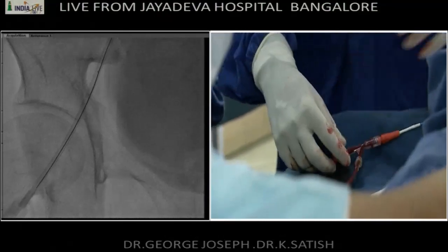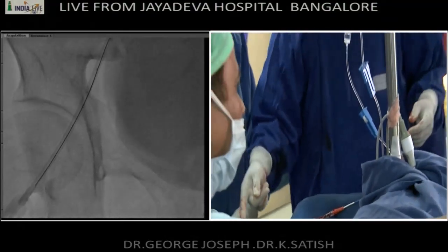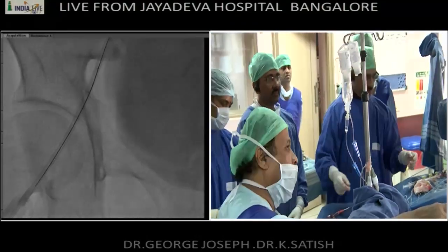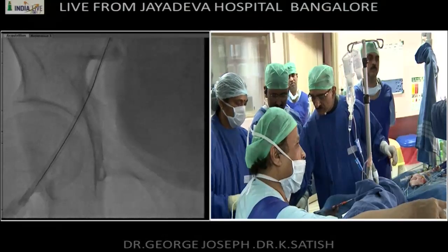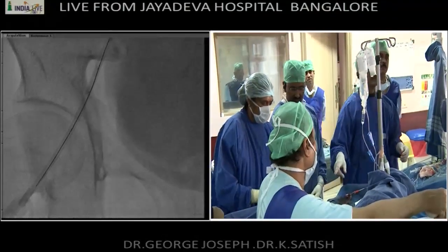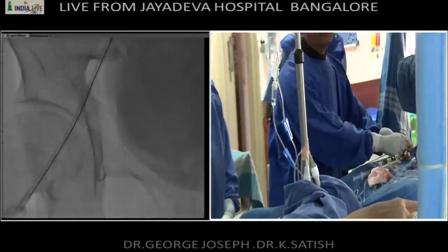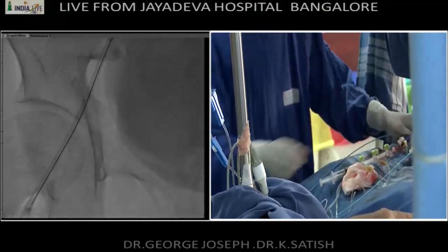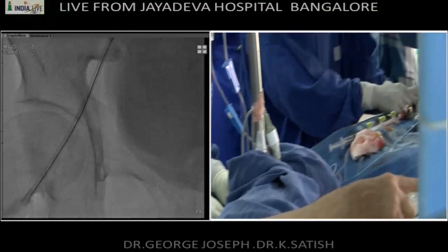Yeah, so we can trap it now. Can you inflate it? What is the size of the balloon? 3. All right. Are you at 10? Go up. Okay, the balloon is inflated, and now I'll pull the guider out while you feed in from here. Can you feed that?